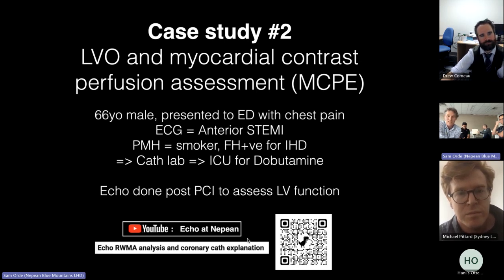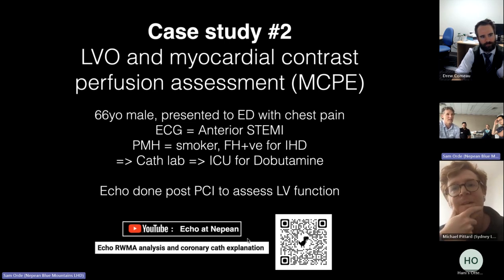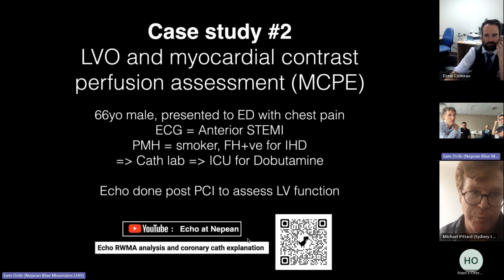It's certainly been shown to be safe in that population as well. And there are also studies showing it's safe in patients with congenital heart disease. So all of the areas that have been given black box warnings, that black box warning has been reduced. They still say you've got to do it with cardiopulmonary monitoring for at least 20 to 30 minutes for everyone, and have medications available to deal with anaphylactoid type reactions. That's what the guidelines suggest. I don't know of any studies where they've actually done it with a PA catheter in. Okay, thank you.